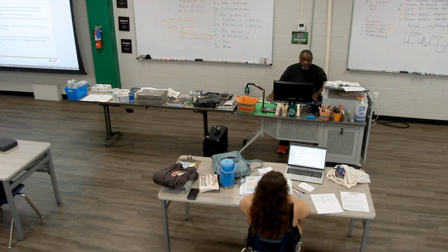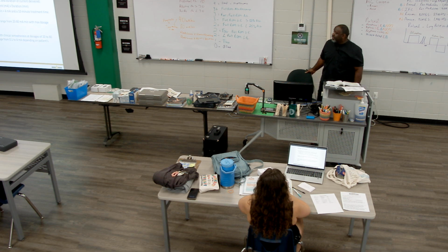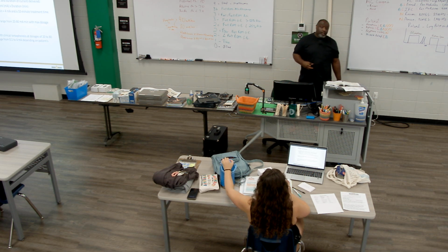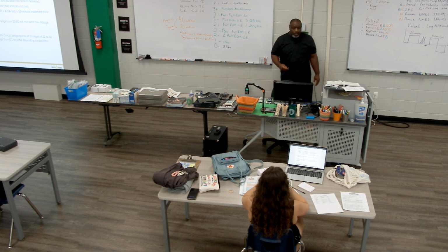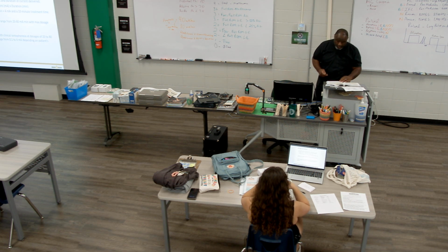Okay, so the main thing is, how is the dosage reported, how is treatment prescribed? Milliamp minutes. So that's how we're going to do it, milliamp minutes. And it's based on, like I said, the PT will normally give you some kind of clarity. They may say, I want 40 milliamp minutes. If they don't give you clarity, then 40 is a usual standard for treatment. It's where we want to start and then build off of 40.